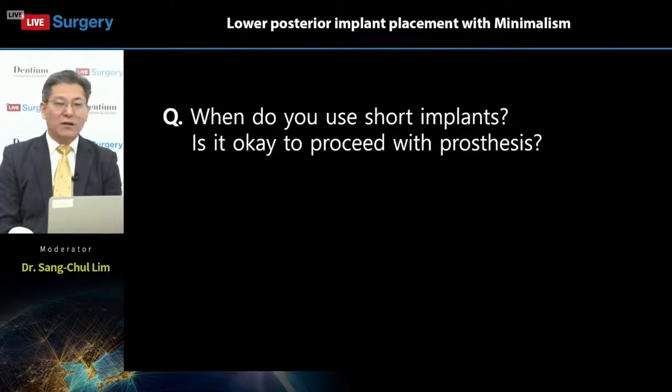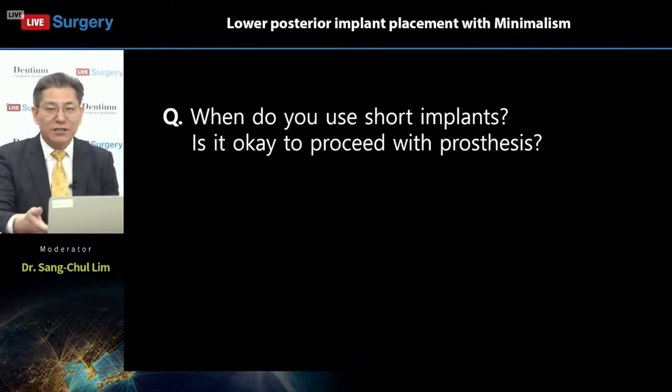Now we have one question. The question is, when do you use short implants? Is it okay to proceed with the prosthesis? Absolutely yes, of course yes. First of all, the indication for short implants doesn't depend on the connection type, internal or external, or on tissue level versus bone level. All short implants, like a 7 millimeter, and especially today's tissue level 5 millimeter, work.